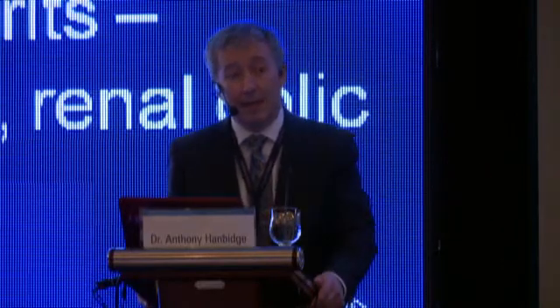And then if that doesn't solve the problem, I do a quick, more general survey, and then if enough time has lapsed, I just say, well, maybe I'm not going to answer this with ultrasound, and I'll give the emergency physician a call, and then there's some discussion about whether or not a CT scan should be performed. So how do I look for acute appendicitis? We'll start with a little bit of anatomy.